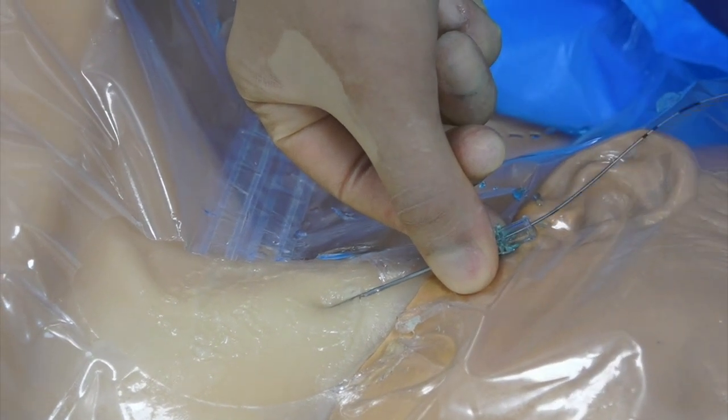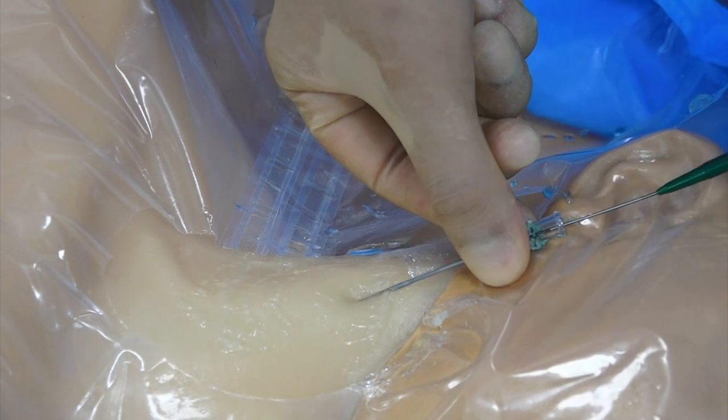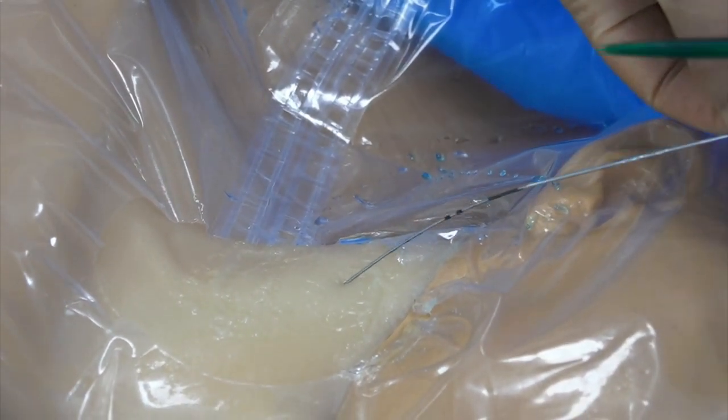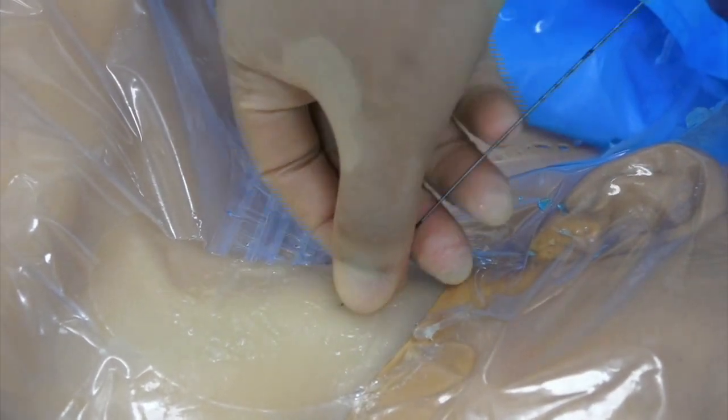Thread the guide wire through the needle. Do not thread the guide wire against resistance. Be careful not to thread the guide wire too deep, as a deep guide wire can precipitate ventricular arrhythmias. Once the guide wire is placed, all techniques for placing the central venous catheter are the same.